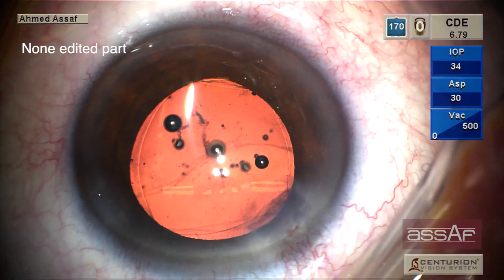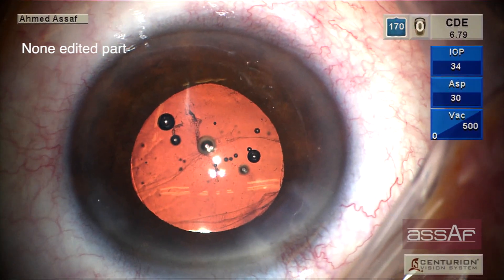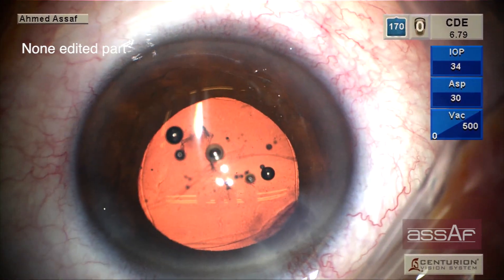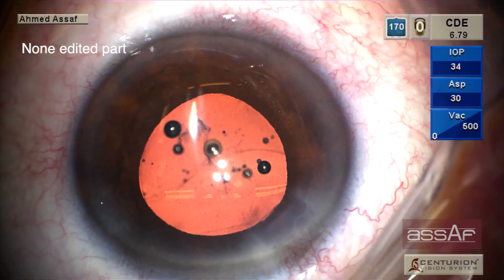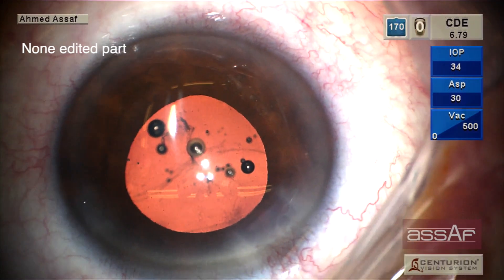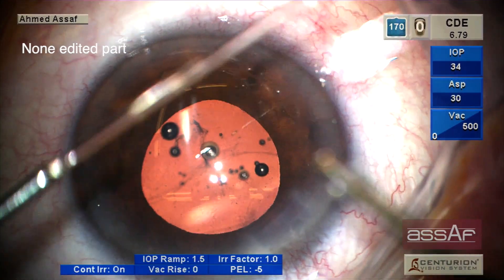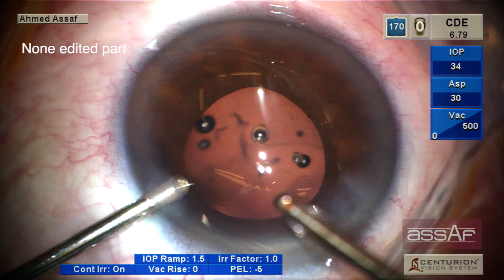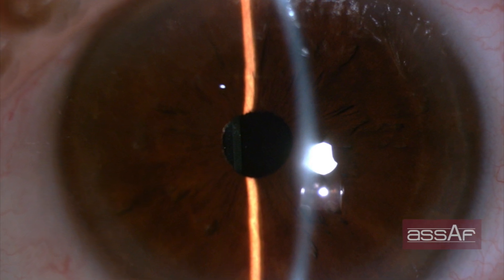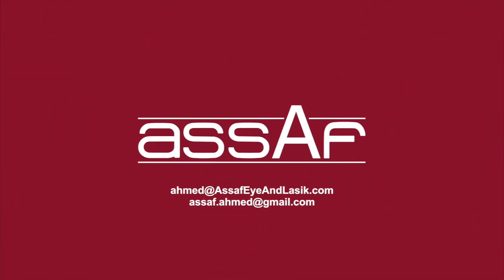So far, I believe I did not have vitreous inside the anterior chamber. I decided against performing pars plana vitrectomy to clear the part of the posterior capsule that might interfere with the visual axis, as I believed it would retract and not interfere. I performed a final irrigation-aspiration just prior to conclusion of the surgery. On the first post-operative day, the surgery looks absolutely uneventful, and the patient enjoyed good visual outcomes. Thank you very much.